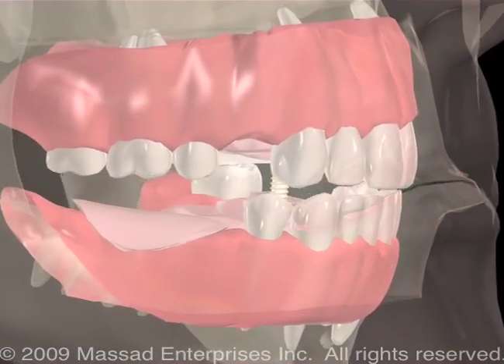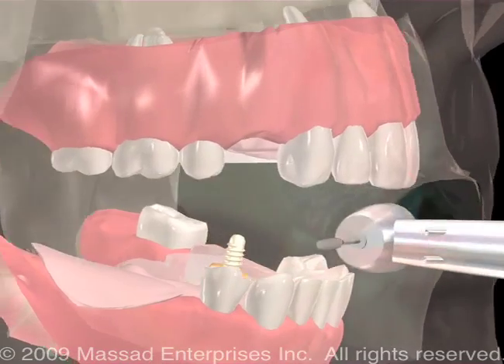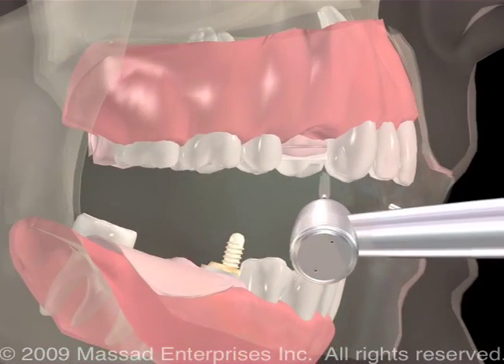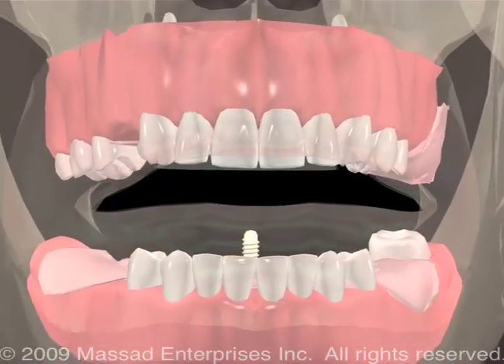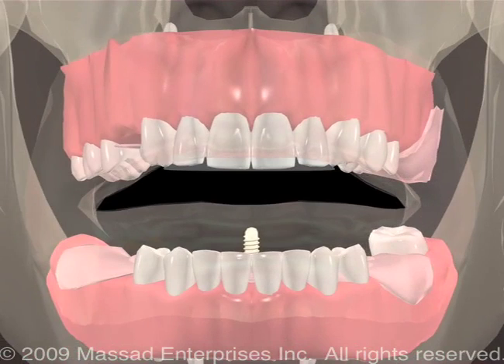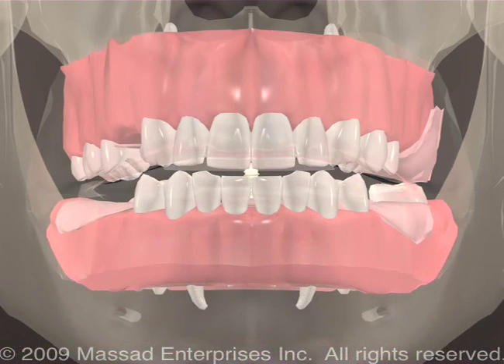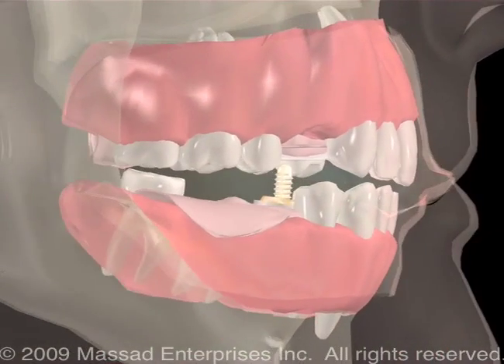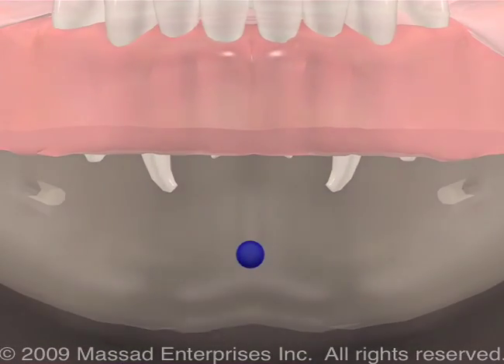Since the patient will be losing these teeth, we have asked permission to adjust the teeth slightly in order for the patient to have a very smooth slide during their movements without the need to open vertical. This is the preferred method, especially if a patient is either having the maxillary or mandibular teeth removed. The patient now can move forward and back without interference and be at the appropriate occlusal vertical dimension.